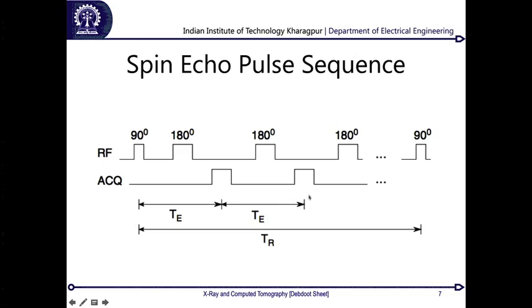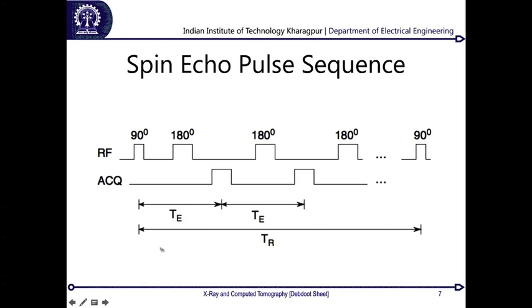Now, as I leave it over here, it will start falling initially into this minimal energy state, and then go down into a zero energy state, and then go down to my low energy state over there. So from here it keeps on decaying like this, and we observe this whole time, which is called my relaxation time, and the total duration taken over here. So once I finish my relaxation time, I again give a reset pulse, which is at 90 degree, and this coming of the reset pulse will align them to this zero energy configuration, and again do the same thing. So this is done over a period of time.